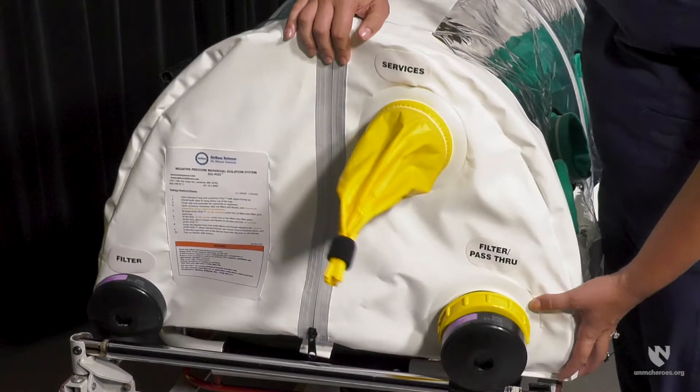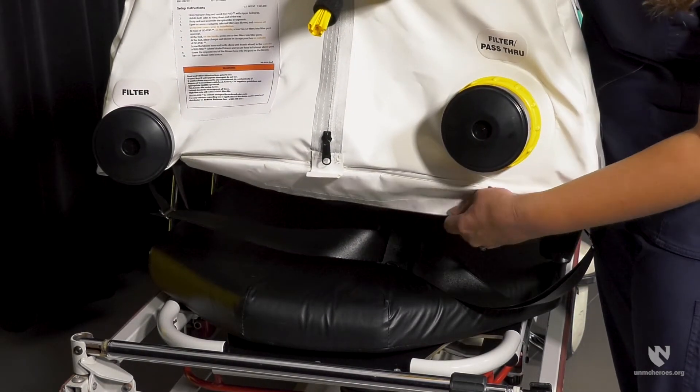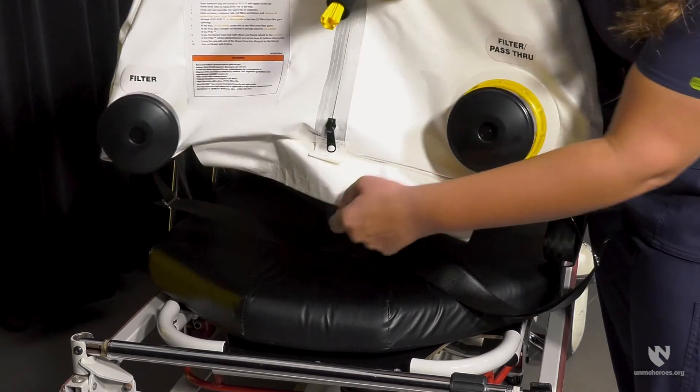The two major updates included on the current AirBoss Defense isopod are a pocket for a spine board and handles on each side of the device. Let's take a look at the spine board pocket. The pocket is located on the bottom of the device, with a pocket opening at the head end of the device.